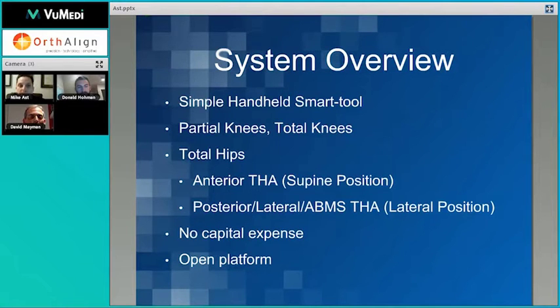Now, we released the hip replacement version of this over the last couple of years, both for patients in a supine position, for instance, for a direct anterior approach, or for patients positioned in a lateral position for a posterior approach or a direct lateral approach, or even an anterior-based muscle-sparing approach in the lateral position.